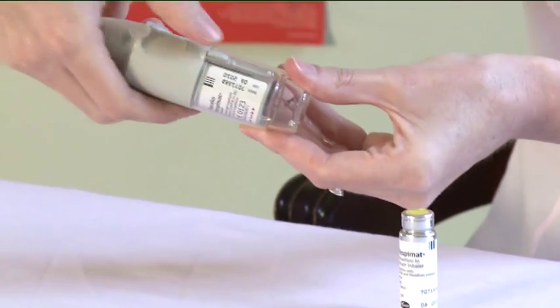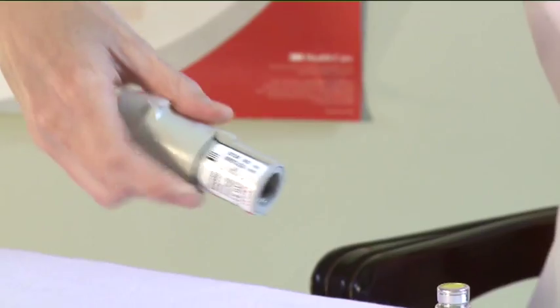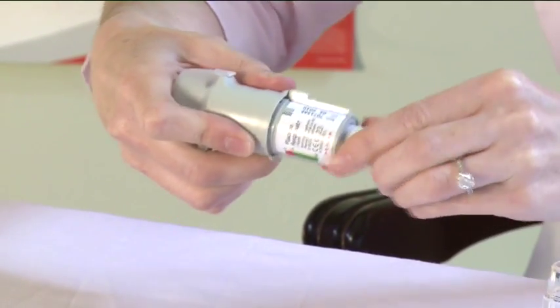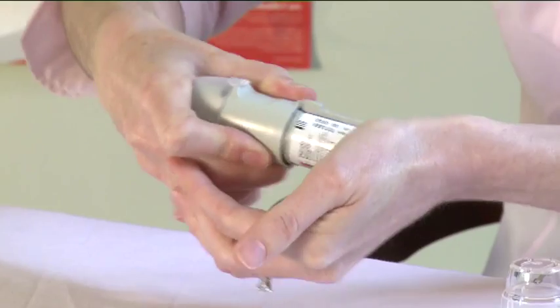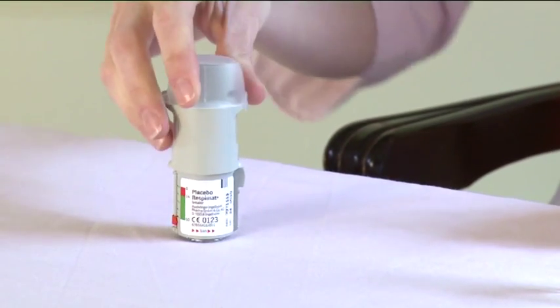To do this, press the safety catch on the side of the inhaler and pull off the clear base. Push the narrow end of the cartridge into the inhaler until it clicks into place. The cartridge should be pushed gently against a firm surface to ensure that it has gone all the way in.